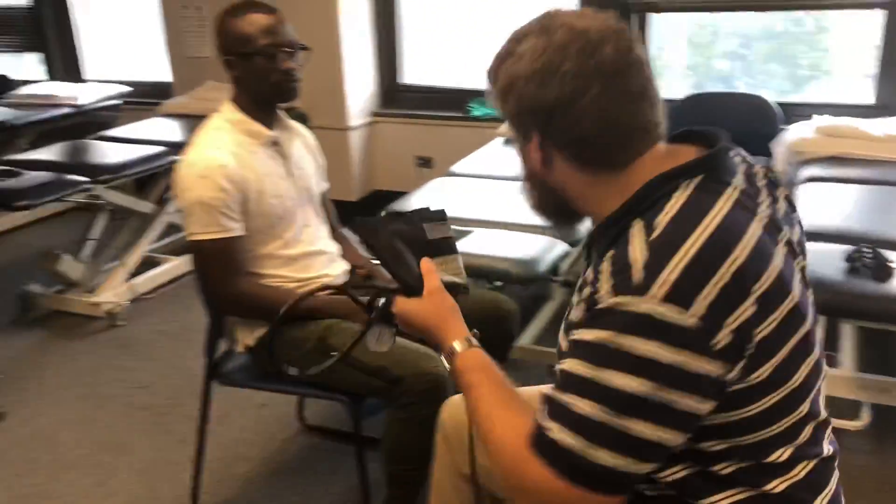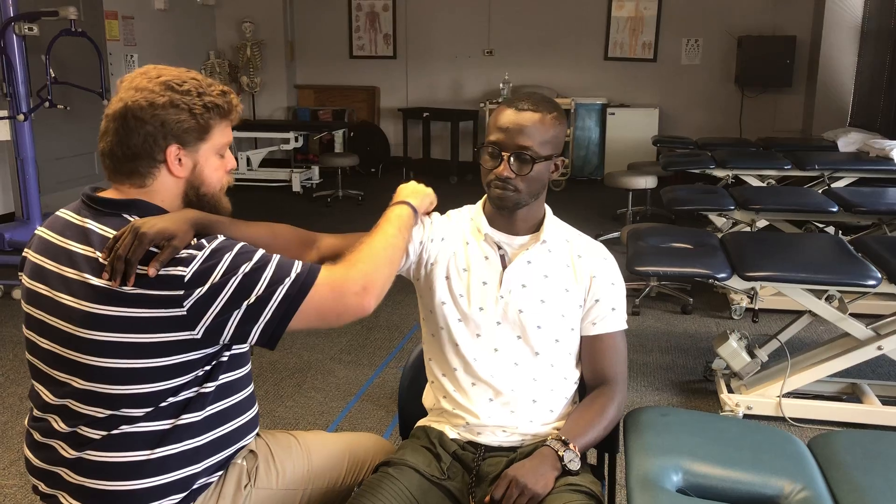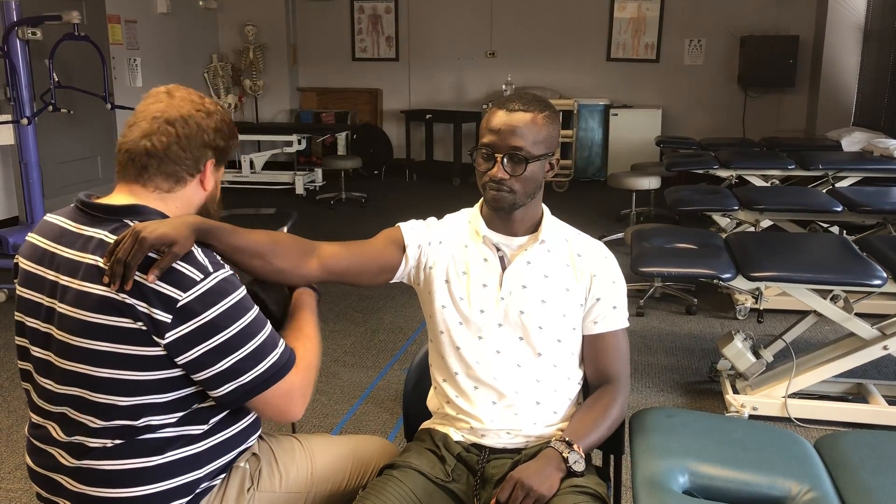To make things easier, we could have Yomi rest his arm on the table here, but I teach a method that you can use anywhere. Yomi, can you place your arm on my shoulder here? This way he keeps his arm supported, I have both hands free, it's nice and easy. Roll up his shirt sleeve there. You can use the table, but again, you might not have a table. So this technique works pretty well.